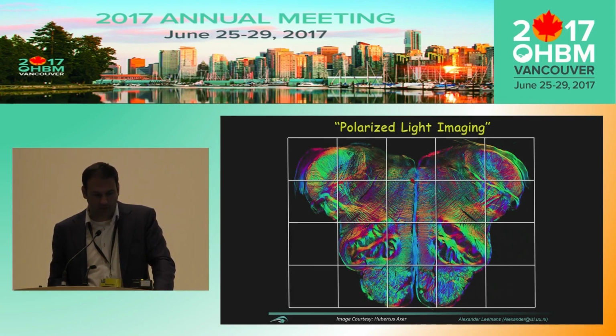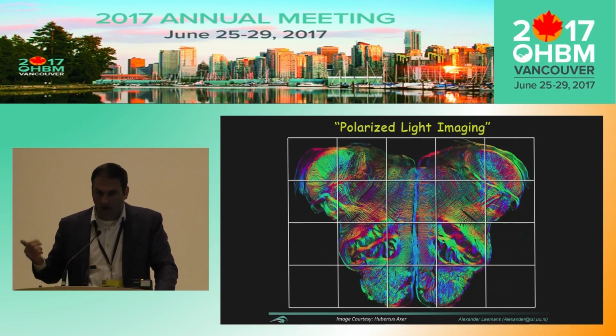Okay, so this is our typical 2 by 2 by 2 voxel size, and you can appreciate the heterogeneity of all these orientations here, right? So indeed, people saying like, let's just acquire data with some higher resolution and we'll get rid of these crossing fibers. Well, that's not going to happen. Okay, even axons branch. Okay, and this is at the micrometer level.